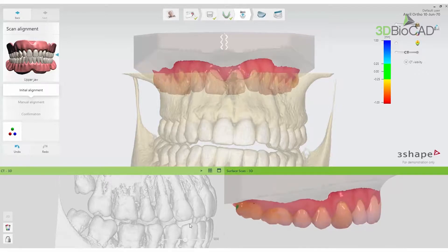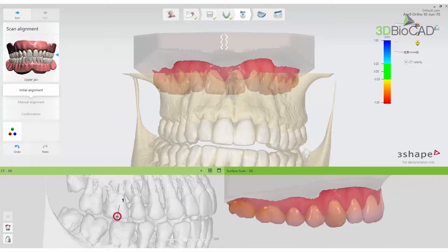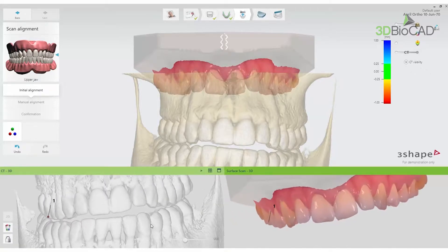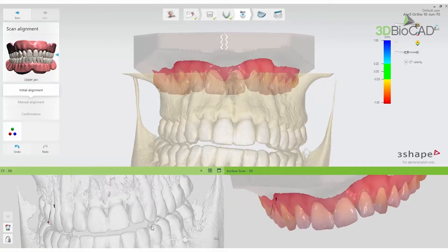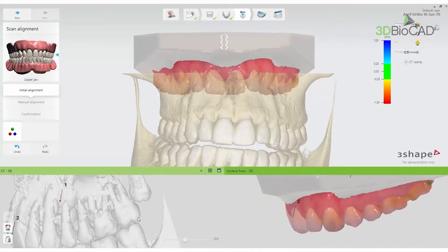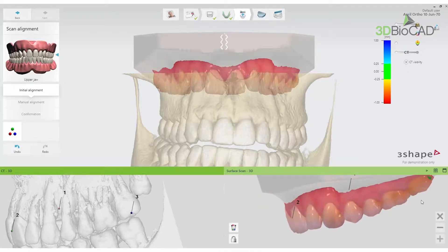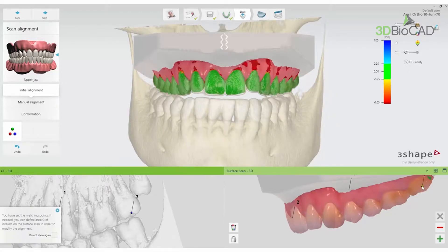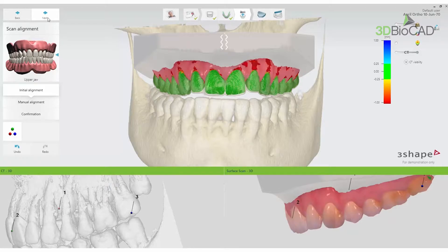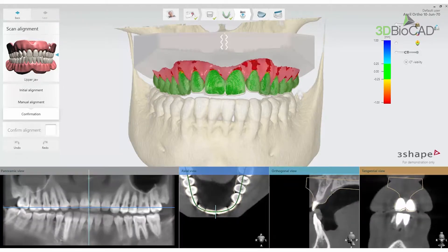Now you are ready for alignment of the upper jaw. Place three points on each scan on a molar on both sides and one of the incisors. The resulting alignment will be shown — a green color on the teeth indicates proper alignment within 0.25 mm. Press Next and confirm the alignment by adding a check mark in Confirm Alignment.